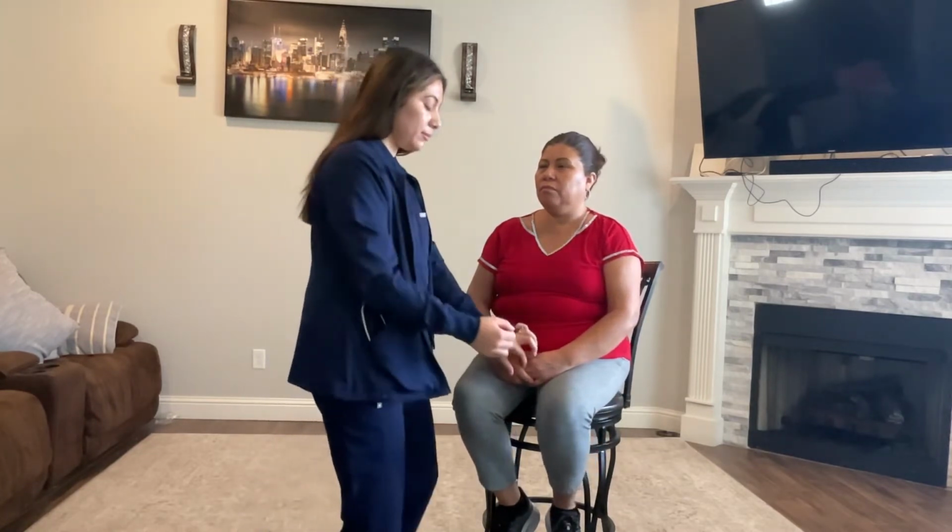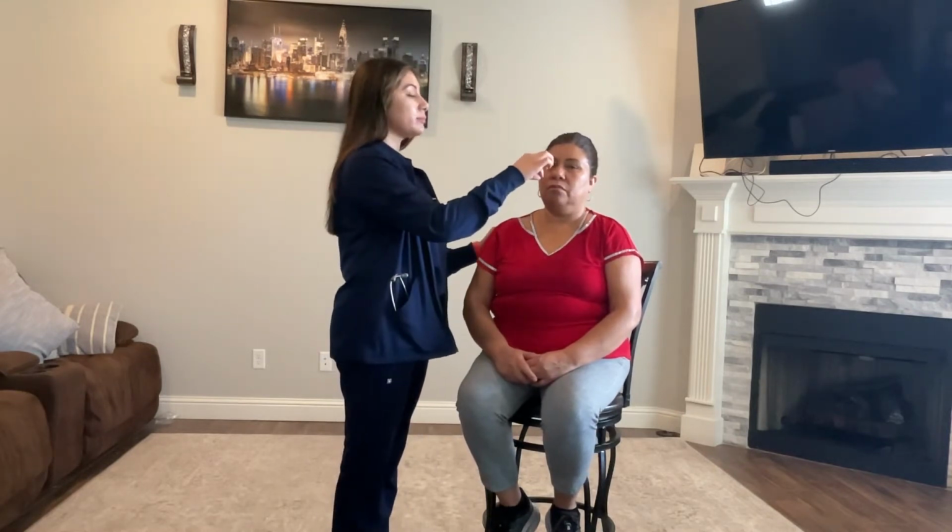I will be checking your vital signs at this time. Put the blood pressure cuff on her. Pulse ox on the finger. And temperature. All right, her blood pressure is 120/80. Her heart rate is 62. Respirations is 16. And her SpO2 is 100 on room air. Temperature is 98.0. All vital signs are within normal limits at this time.